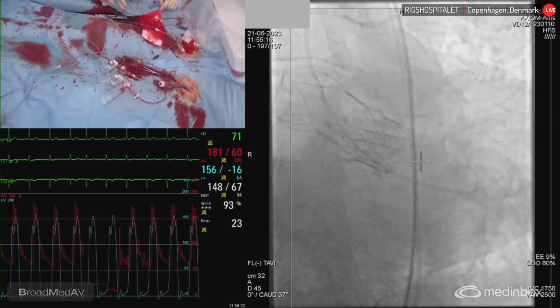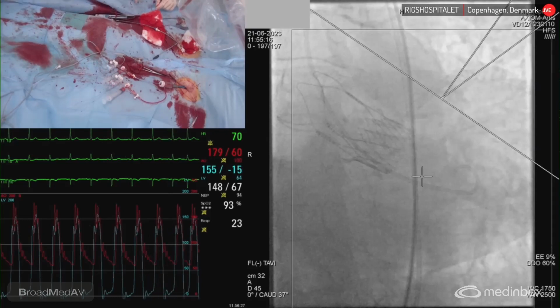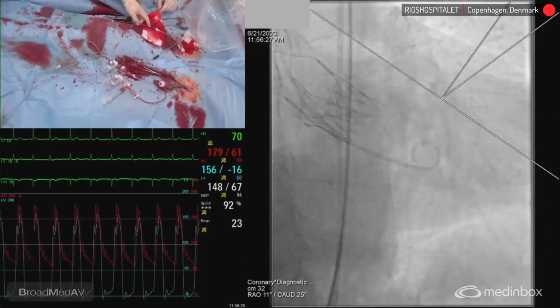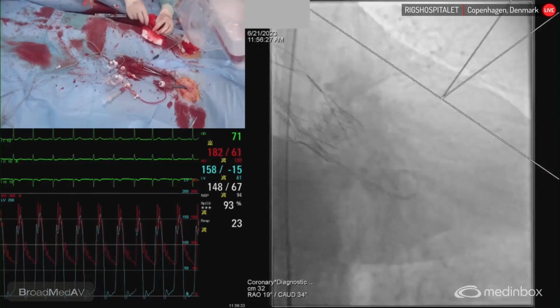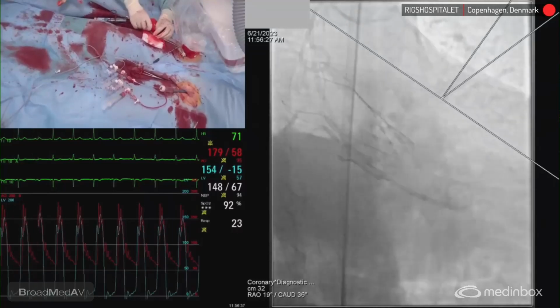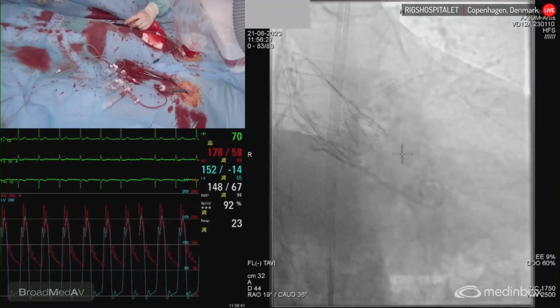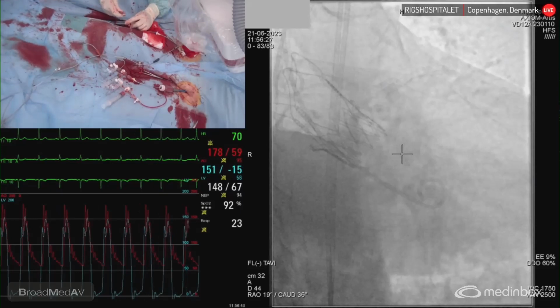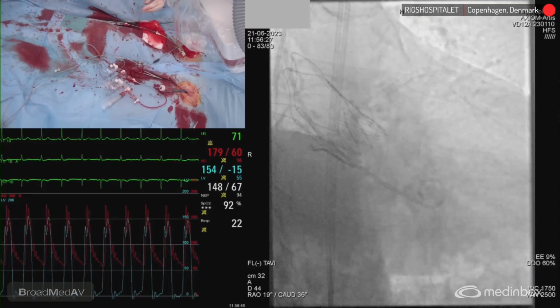And okay, let's go to an 11 and 23. Let's fluoro, please. See if we have overlap or not here. It's not too bad. We can go a tiny bit more and a tiny bit more like this. Here we are happy with it. Yeah. Okay. And yeah, that's good. Injector disabled. Why is that? Okay, maybe we'll check. Have to check it.